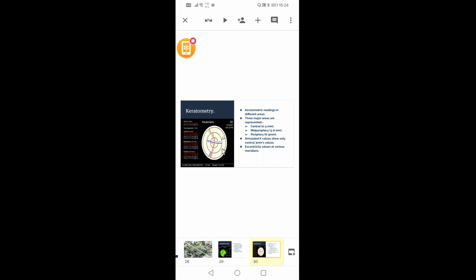But if you choose your first RGP trial lens based on the whole keratometry, your number of trials would reduce, your chair time will also reduce, and the confidence the patient will have in you will be better, because you are doing your thing very quickly, right? I hope you're following me.